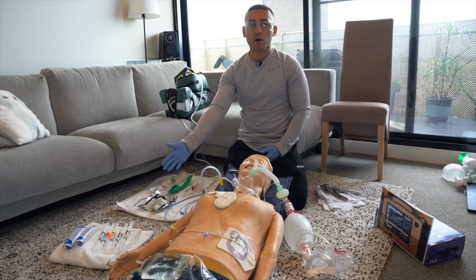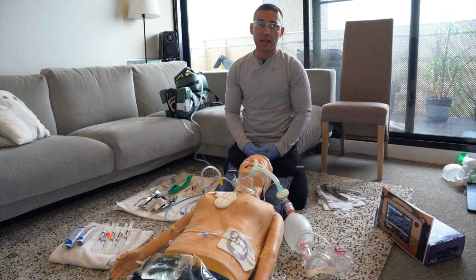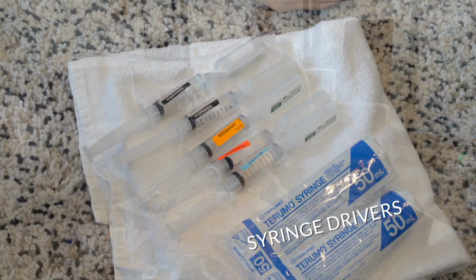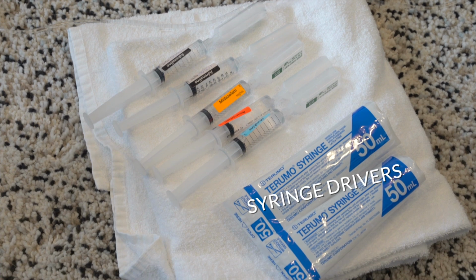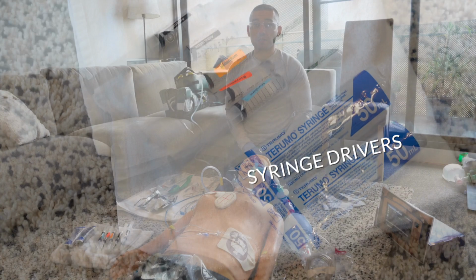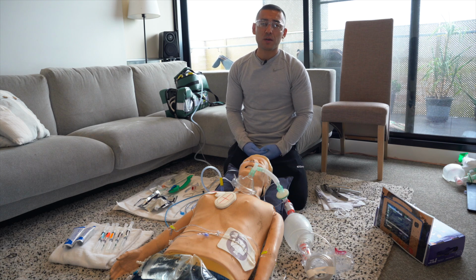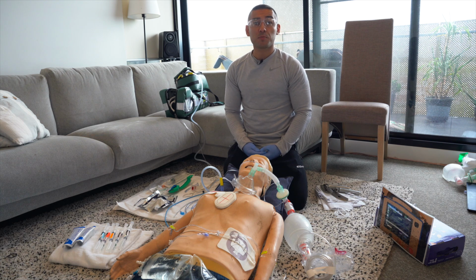On the right-hand side of the patient's torso, near vascular access, is where the medications are placed. Vascular access should comprise 2 x 18 gauge or larger if possible. If unable to attain venous access, IO should be sought. Required medications drawn up into syringes will include sedation, paralysis, both for induction and long-term, atropine, as well as inotropes such as adrenaline, 1 in 10,000 and 1 in 100,000. There will also be 2 syringe drivers, one with post-intubation sedation and the other for an adrenaline infusion.